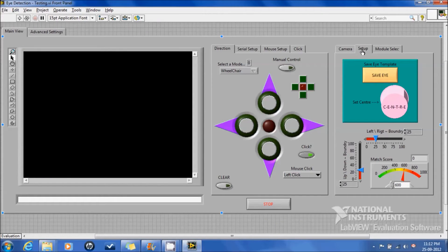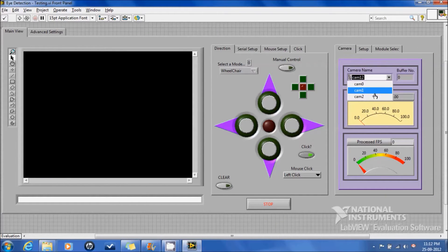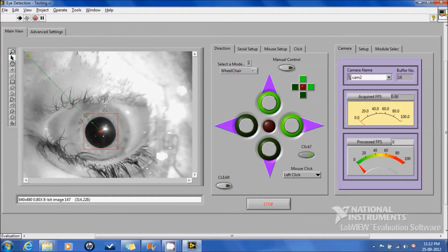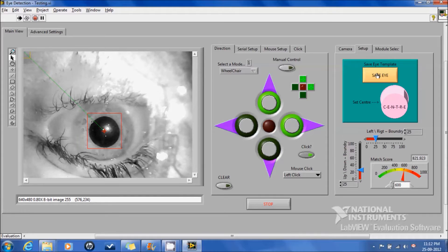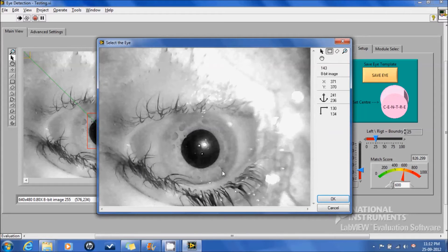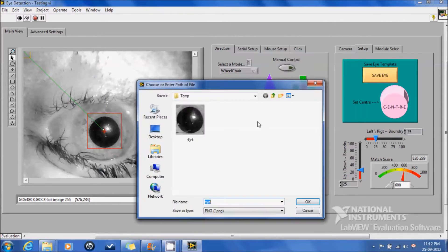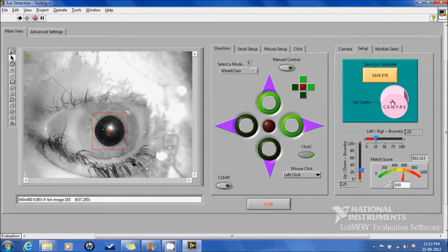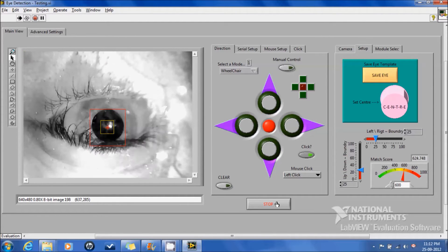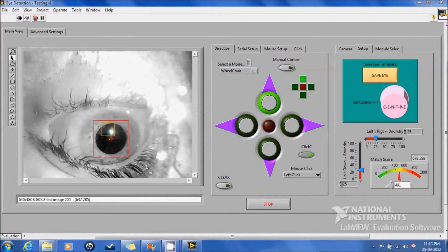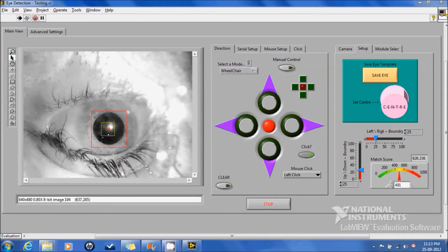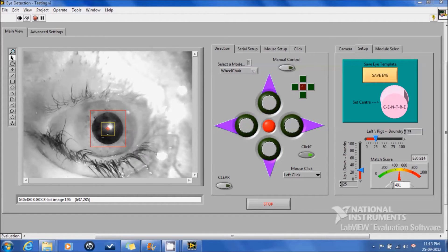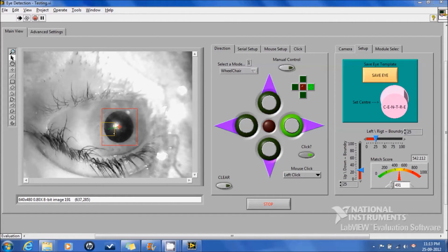Here is the front panel with various controls. Initially we select the camera and run the program. The templates of the eye are saved and used to track eye movements. You can see that when the eye is moved, the program processes the image and makes the corresponding LEDs on the front panel illuminate, indicating the direction to be moved.